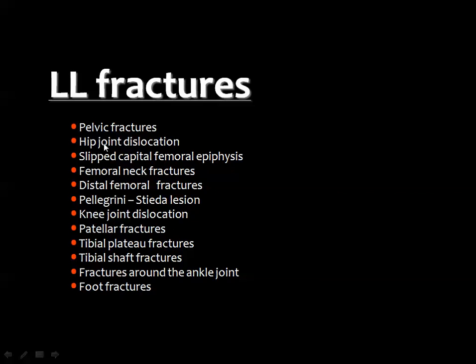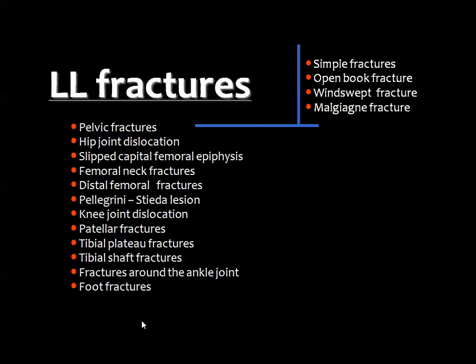Then we have some words about hip joint dislocation, slipped capital femoral epiphysis, femoral neck fractures, distal femoral fractures, Pellegrini-Stieda lesion, knee joint dislocation, patellar fractures, tibial plateau fractures, tibial shaft, fractures around the ankle, and finally we'll have the fractures of the foot.